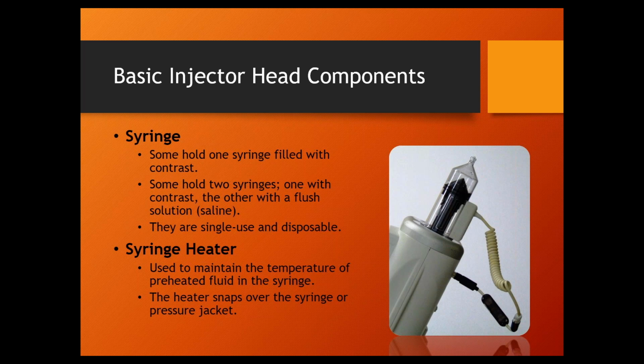There's two exceptions. Two of the MedRad injectors, the Mark V Plus and the Provis, have the same exact syringe. And the Bracco units, the Angiomat Illumena and the CT9000, which is ancient, they have the exact same syringes. But those are the only two that I know of that are duplicates of each other. But yeah, so anyway, the contrast fluid.